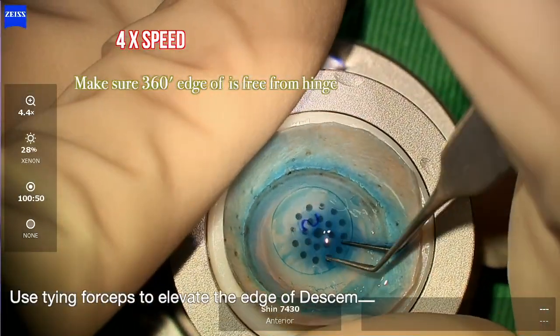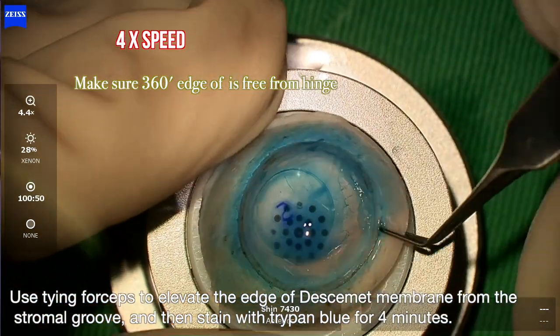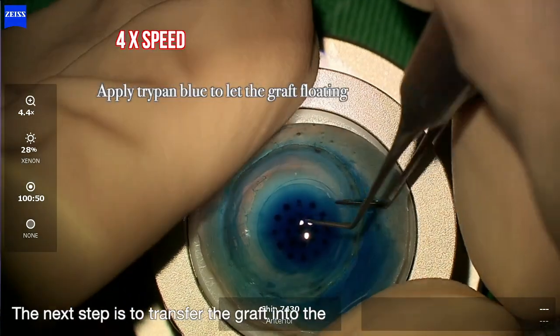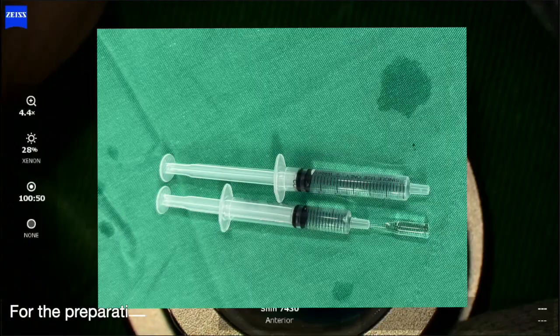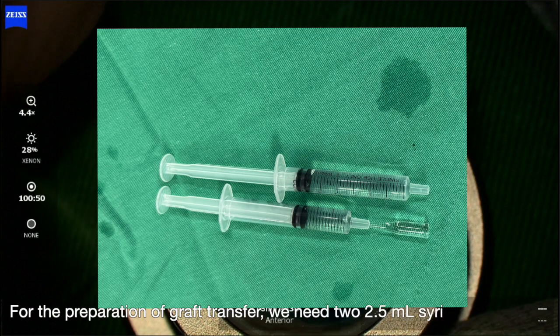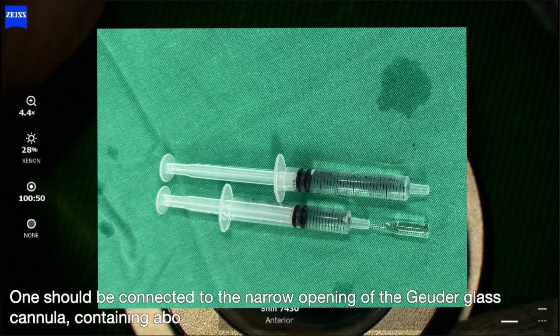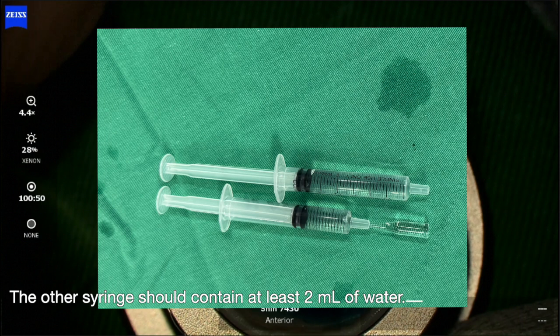Use tying forceps to elevate the edge of Descemet membrane from the stroma groove, and then stain with trypan blue for 4 minutes. The next step is to transfer the graft into the Jones glass cannula. For the preparation of graft transfer, we need two 2.5 ml syringes. One should be connected to the narrow opening of the Jones glass cannula, containing about 1 ml of water. The other syringe should contain at least 2 ml of water.